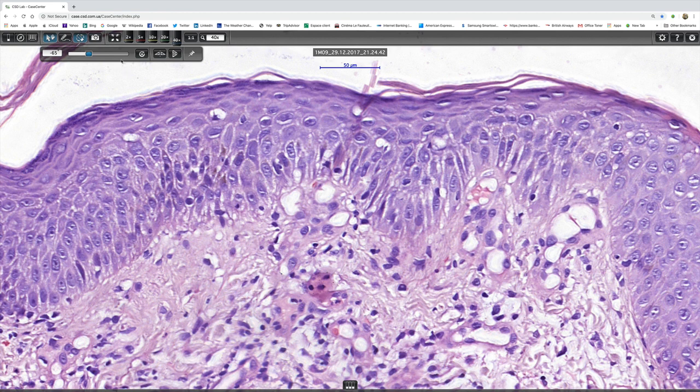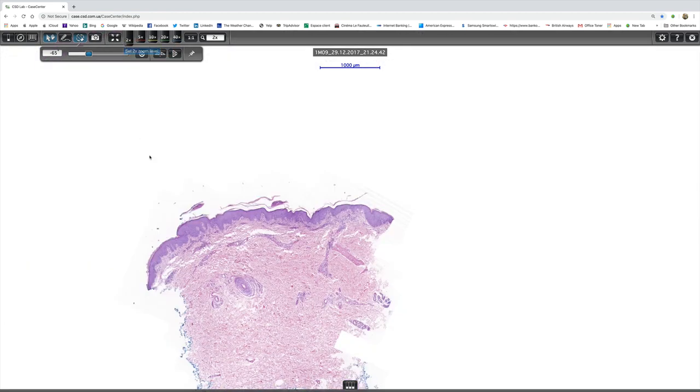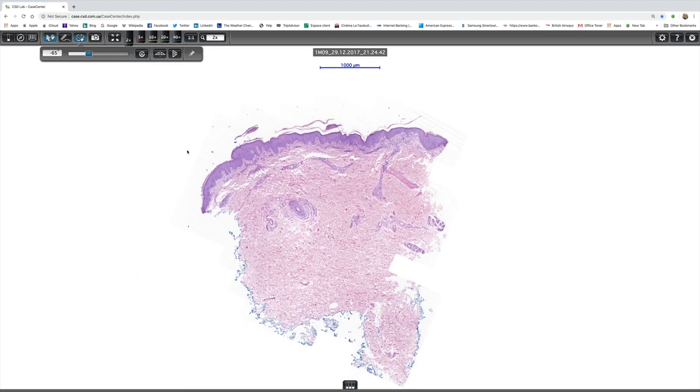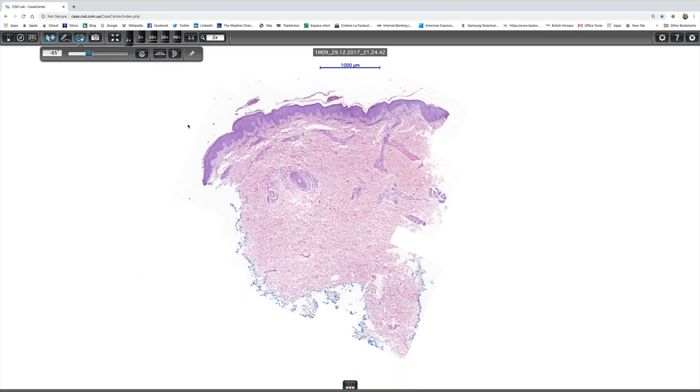So on the basis of the histology, it's just diagnostic of guttate psoriasis.